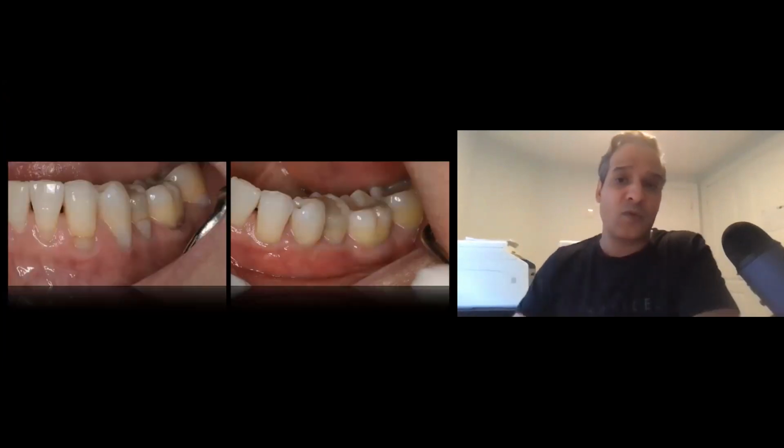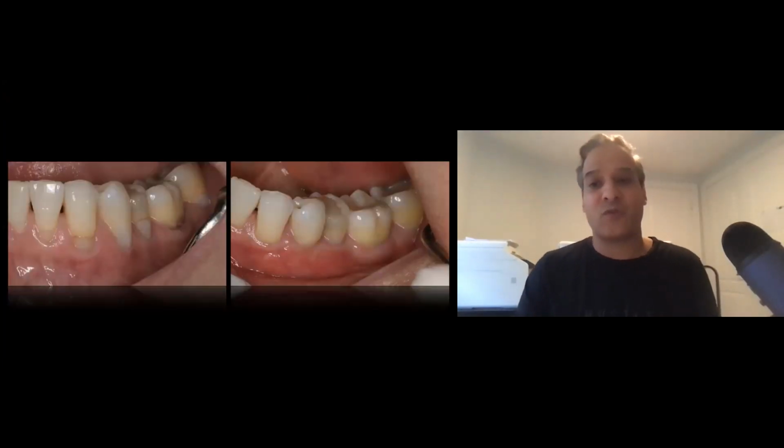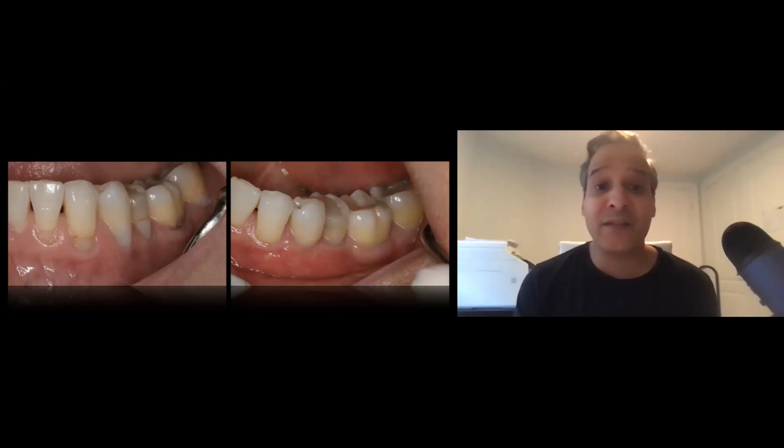So you go from basically before to after. She's quite happy with it. She didn't have to do any other restorative work. This is just basically how the tissues healed. I had told her you may have to replace or adjust some of the fillings afterwards, but it ended up turning out pretty decent, and she was happy with the result, and she didn't want to do anything. In my opinion, it looked pretty good. So I was happy too.